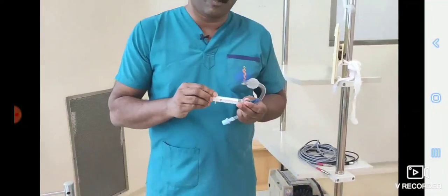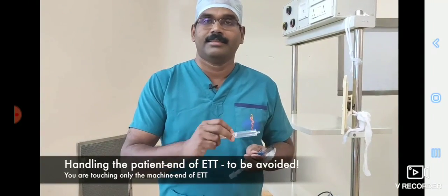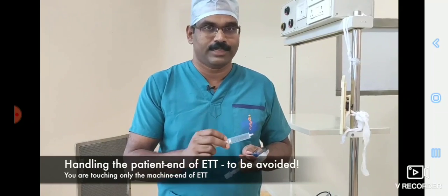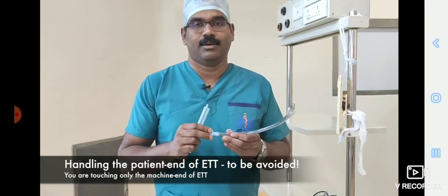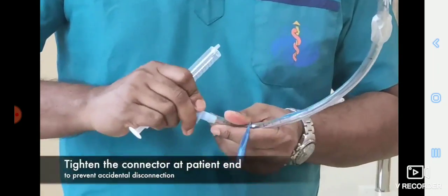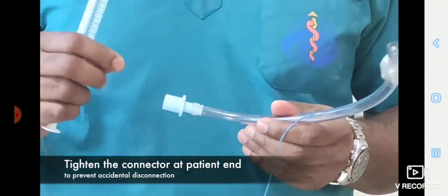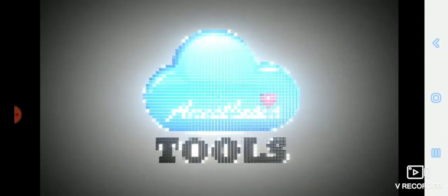Remember, after opening from the sterile pack, you do not handle the patient end of the endotracheal tube. You will be handling only the machine end of the tube, and you have to attach the connector firmly before laryngoscopy and insertion into the trachea.